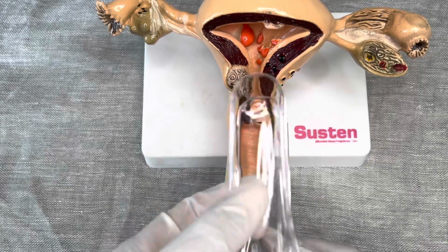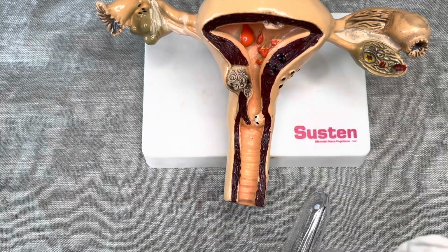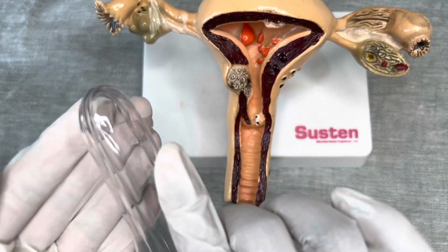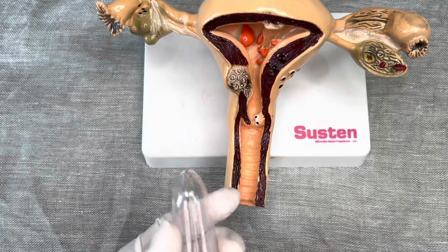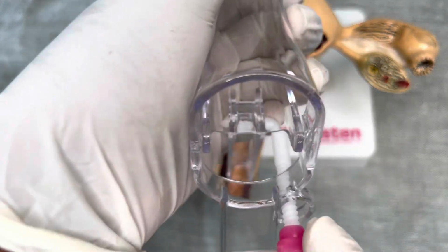So once you have opened, and by the way, you cannot just put this thing in without having to do what? To put some lubrication. So you'll have to put some lube, yeah? You see? You have to lubricate the speculum before you insert it, and then it goes in like that, and then you twist, and then you open, and then you can see it has the screw thing, so that is supposed to secure it so that it does not move.